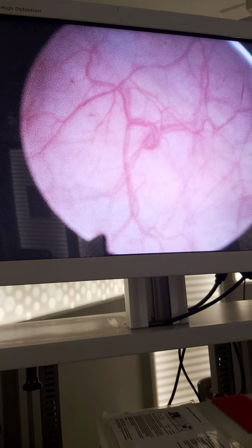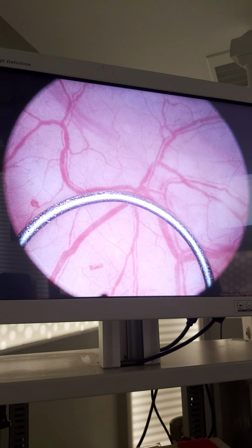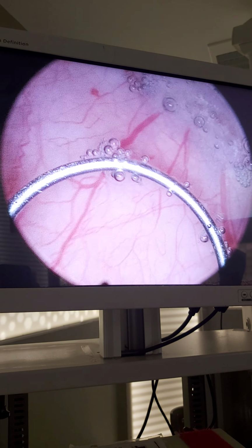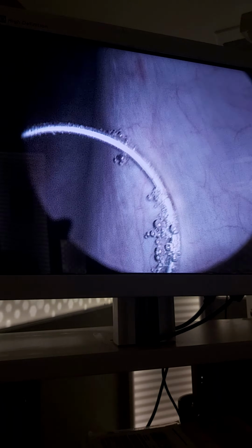There is a more reddish part. This may be the part that comes into contact with the trigon. So I will mark here to make a fulguration there. Not to forget. And the other side wall. Okay, still here also, when I look at this, I see a dirty appearance in these tissues. And when I scrape, look, there is a membrane covering the tissues.